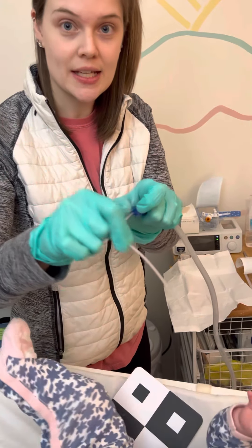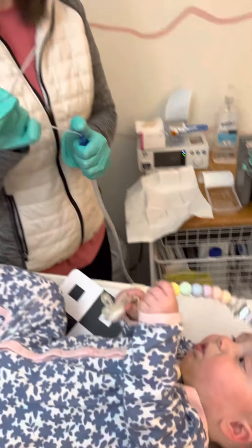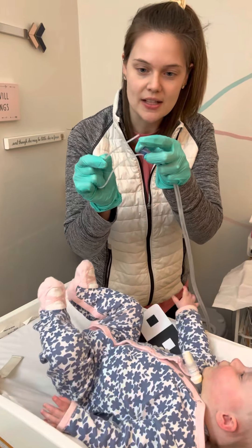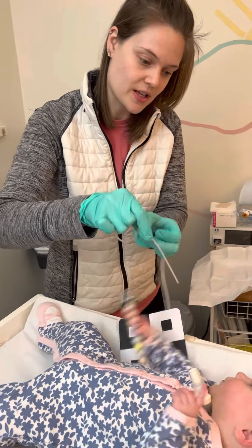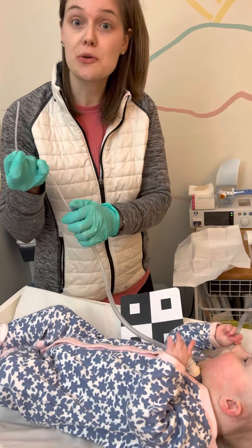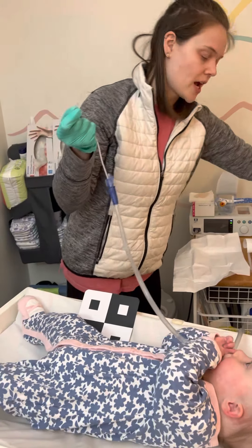Occlude your thumb over the hole and hold it down while you're going in and while you're coming out. You don't want to stay in her trach for more than five seconds. Occlude your suction catheter, go in, and kind of twist it — the tiny holes at the end of the catheter are what get the secretions out, so you want to turn it to get everything. Go in to your fingers and then come back out. It takes about five seconds; then listen — if you still hear secretions, do it again. Usually two passes clears it, though every once in a while you may need a time or two more.